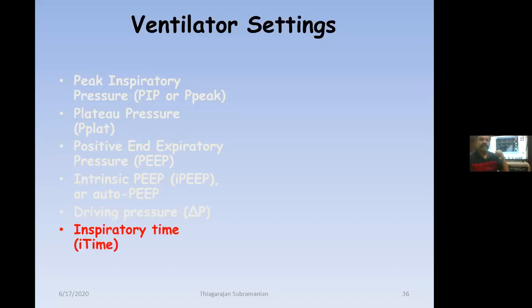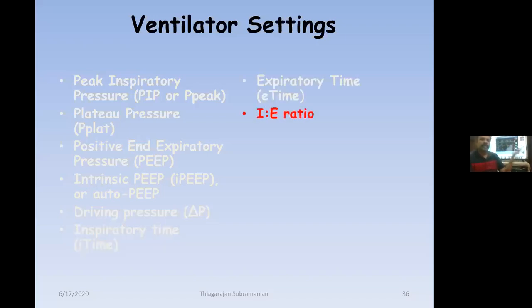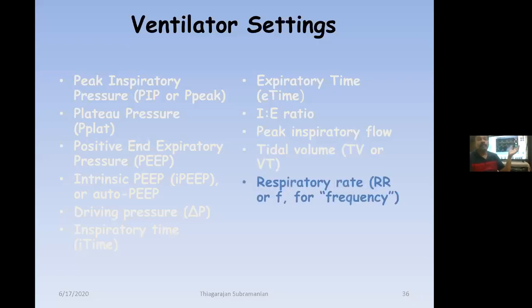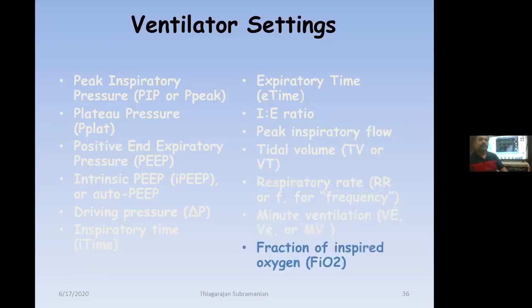And then the time and duration: inspiration time, expiration time, the ratio of inspiration to expiration, the peak inspiratory flow, and tidal volume should be set properly. These are all findings you can see in the different monitoring systems of the ventilator, in the readings. Moreover, FiO2 is very important. Whenever you do the postural drainage technique, it is important to check the FiO2, the fractional inspired oxygen.